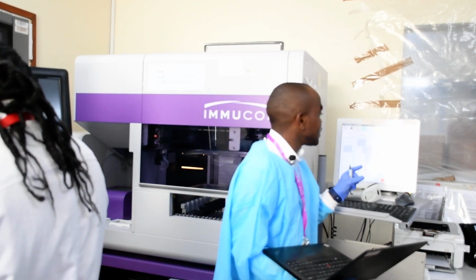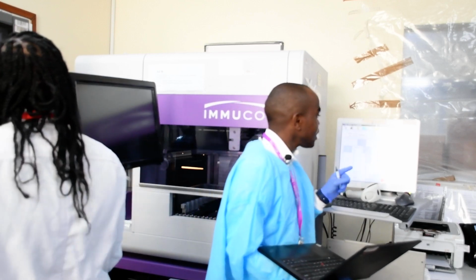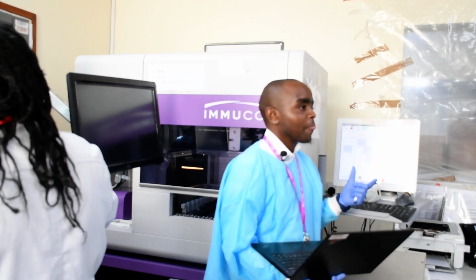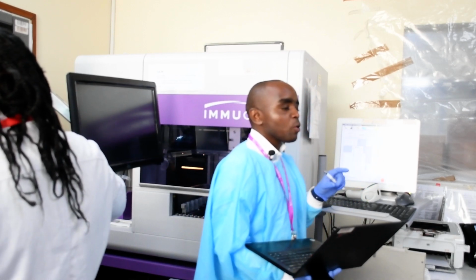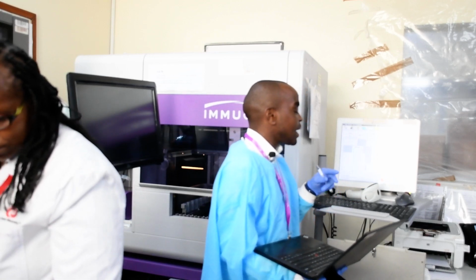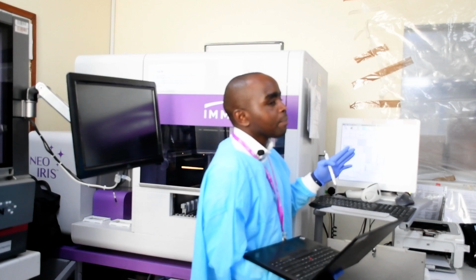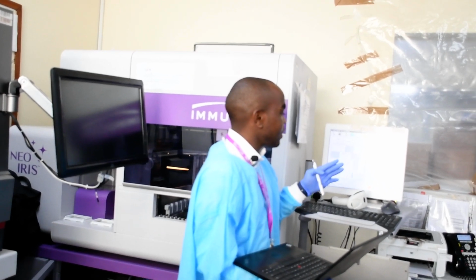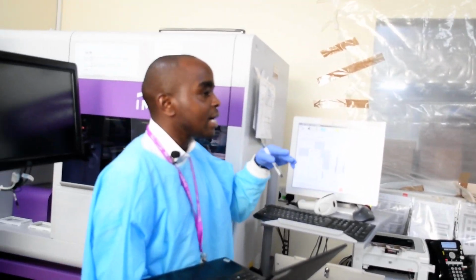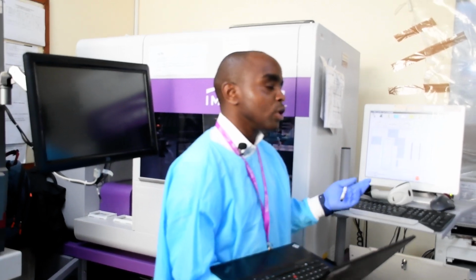Basically, we just want to see the concentration of antibody A and antibody B, especially on blood group O. Because if you transfuse blood group O to AB or other recipients other than blood group O, then those anti-A and anti-B, if they are at a higher titer, are capable of causing hemolysis.